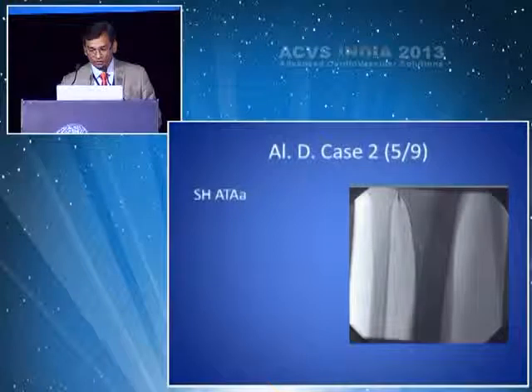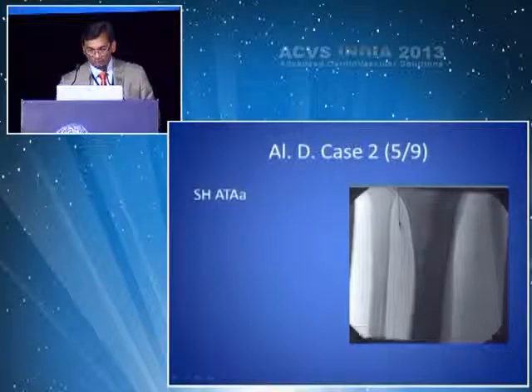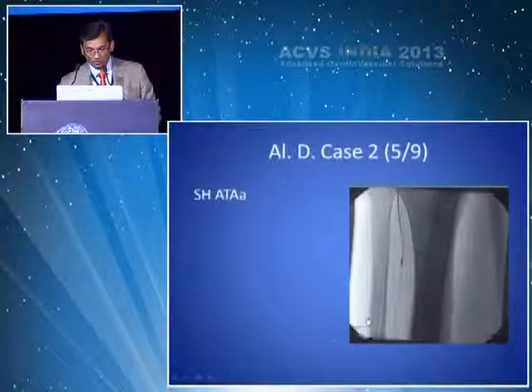And then proceed with Silverhawk. This is now across the long total occlusion. Next.